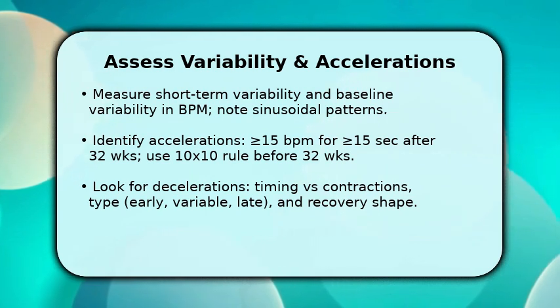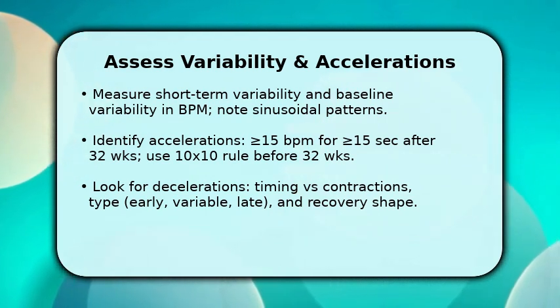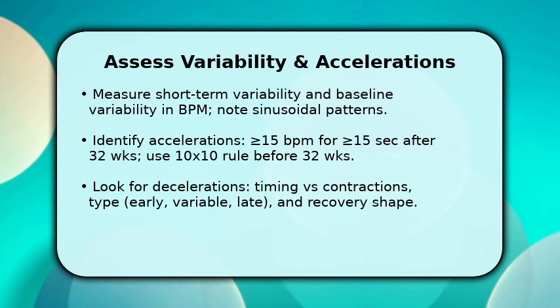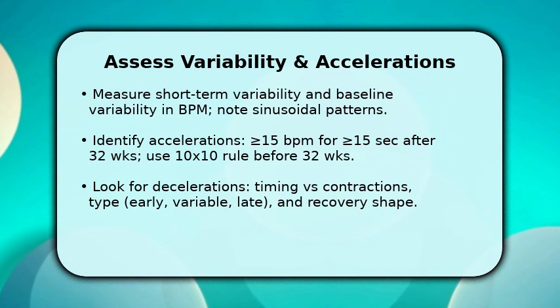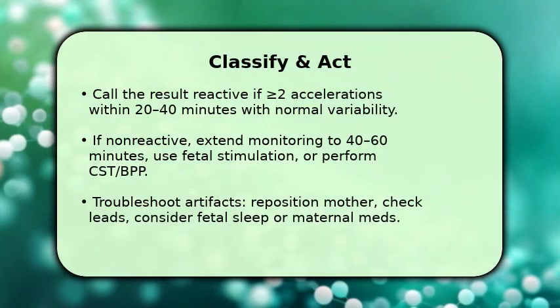Once you've checked accelerations, inspect decelerations and relate them to contractions. Their timing and shape, early, variable, or late, tell you whether issues are benign or concerning, so annotate each event clearly. You finish by classifying the NST.